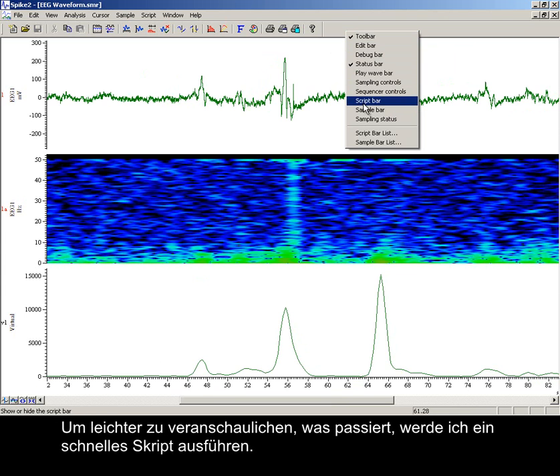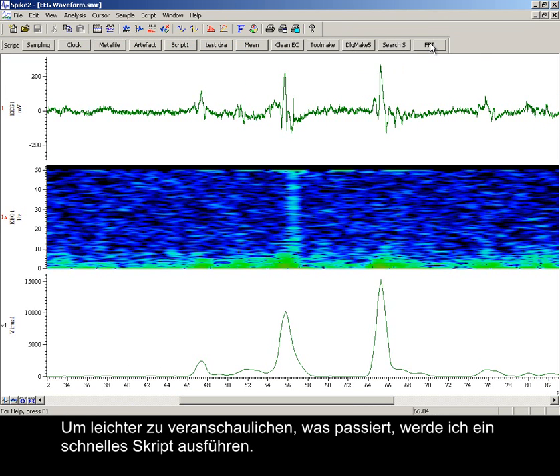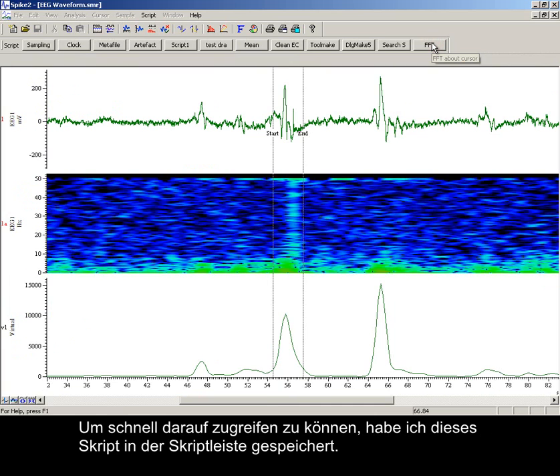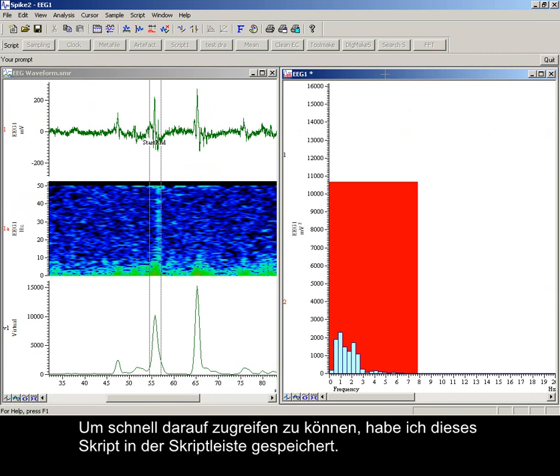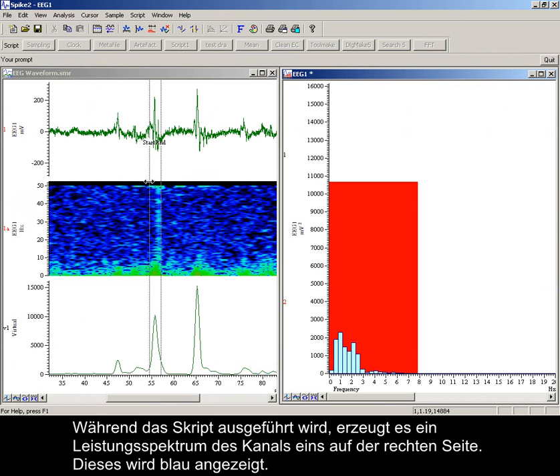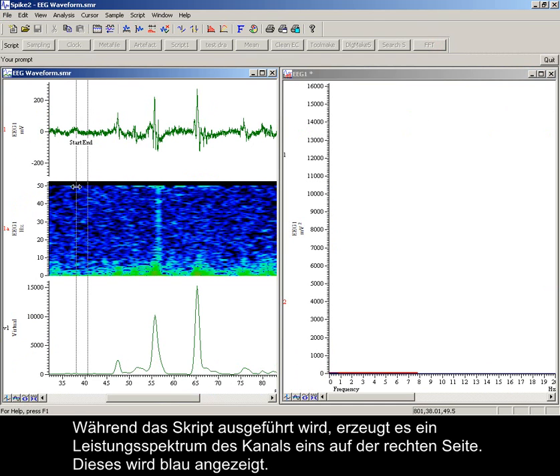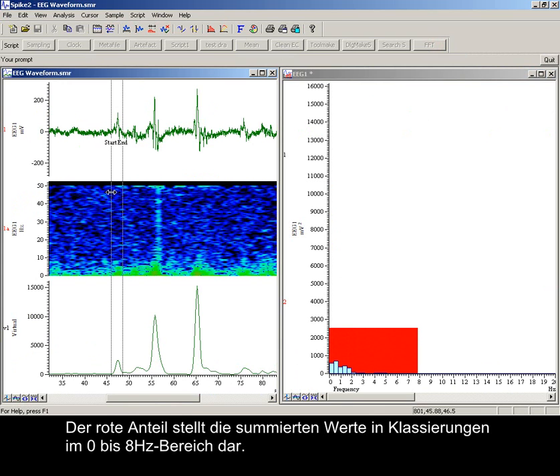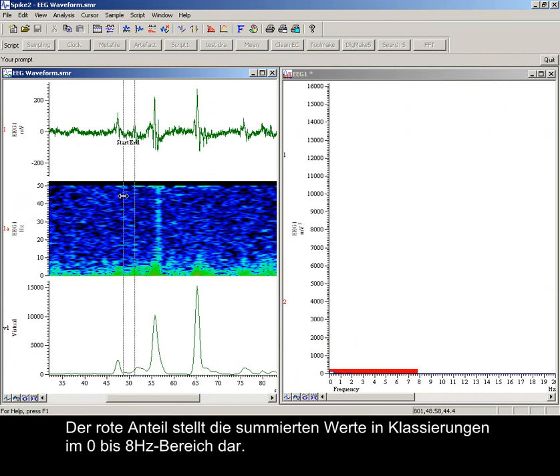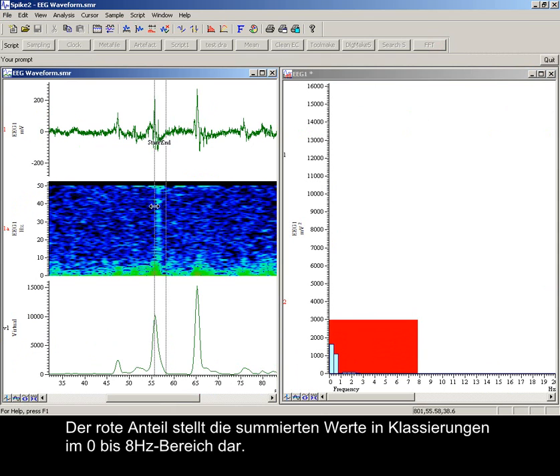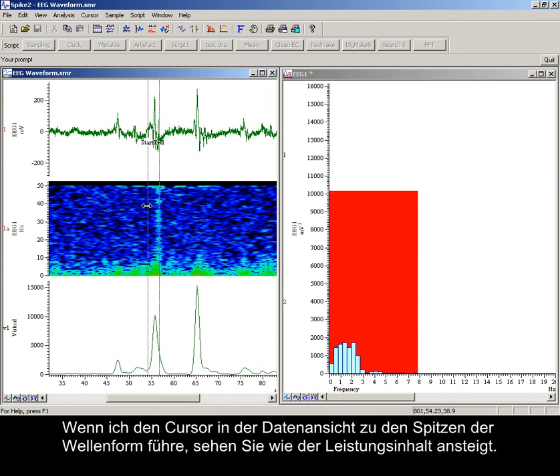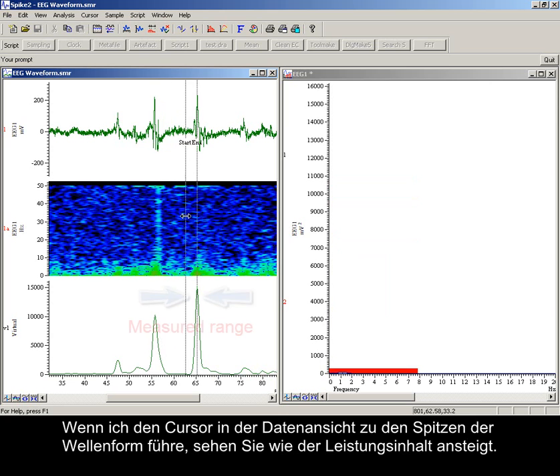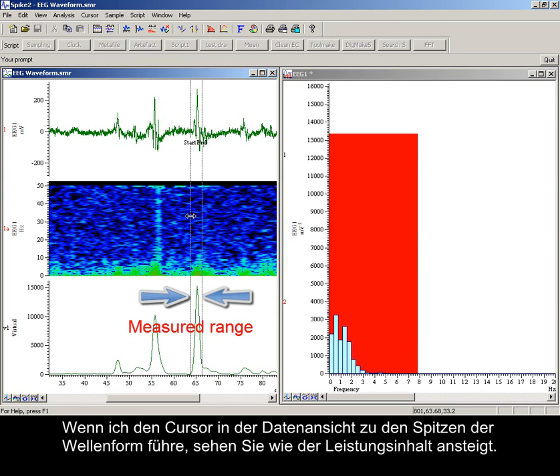To help illustrate what is happening, I'm going to run a quick script, stored in the script bar for easy access. Now the script is running, it produces a power spectrum of channel 1 on the right hand side, displayed in blue. The red portion is a display of the summed values of the bins in the 0 to 8 Hz range. As I move the cursors in the data view to the peaks of the waveform, you can see the power content increasing.